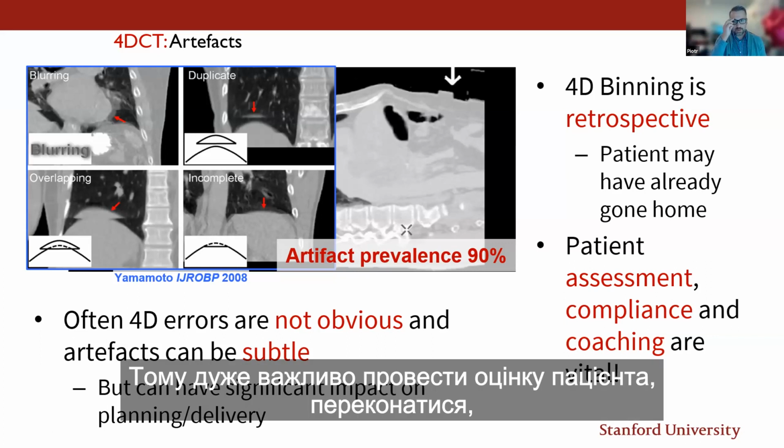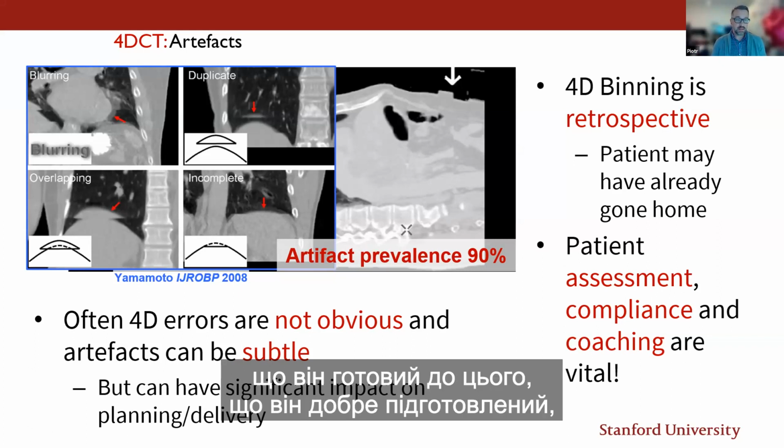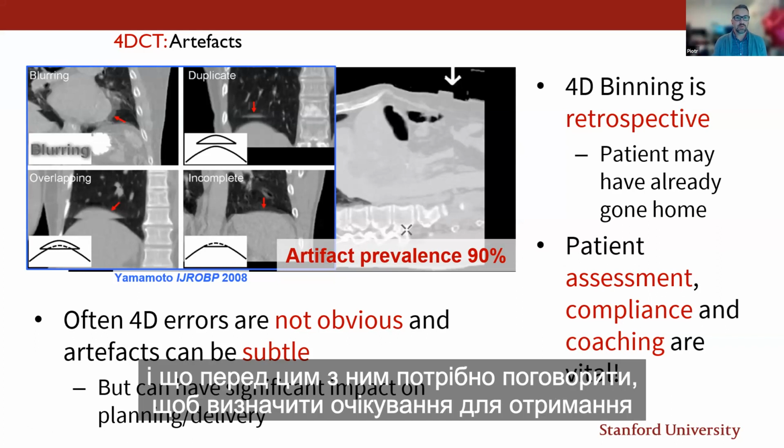So it's very important to do a patient assessment, make sure patients understand what they're expected to do, that they're compliant, and that they're well coached. Have a conversation with the patient before this, just to set expectations to get the best outcome.